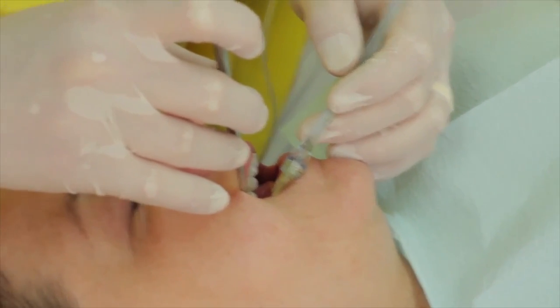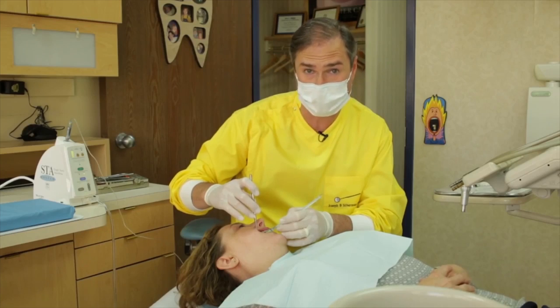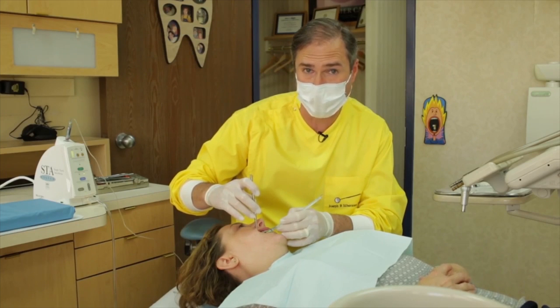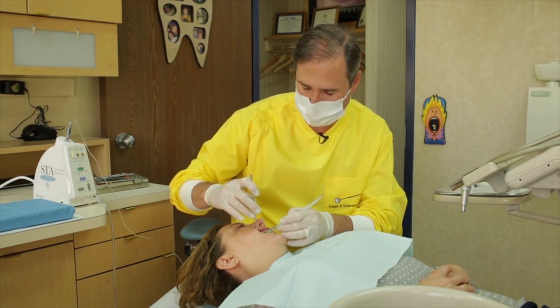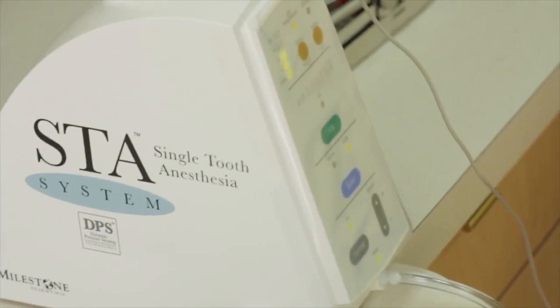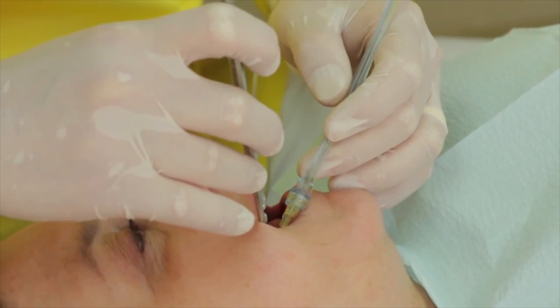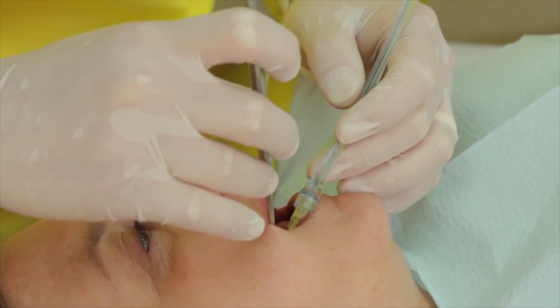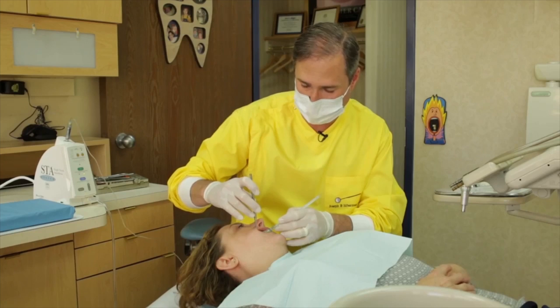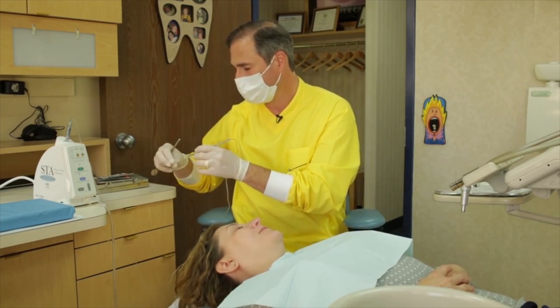I give that a few seconds to work, and as it works more I can actually go a little faster. There are three speeds to the wand. We're on medium. I can then push a little harder and now it goes faster without any pain whatsoever. The beauty of the wand is that I can place the anesthetic really easily by holding it with my pencil grip. We're now done. The patient is beginning to get numb, not in pain.